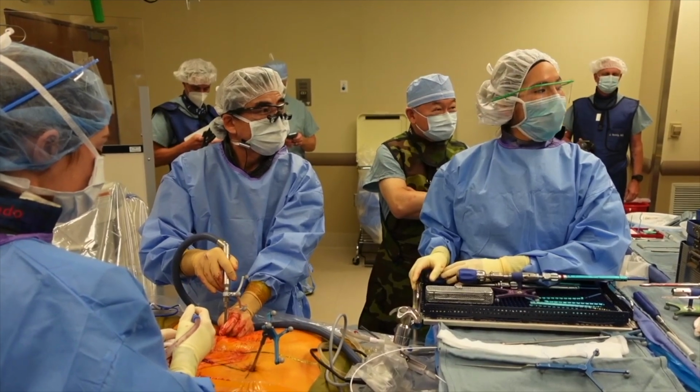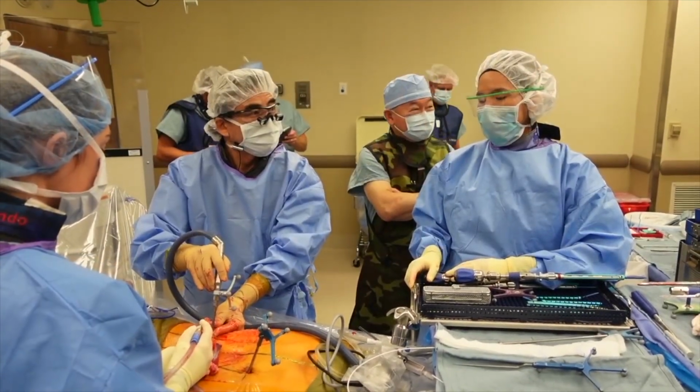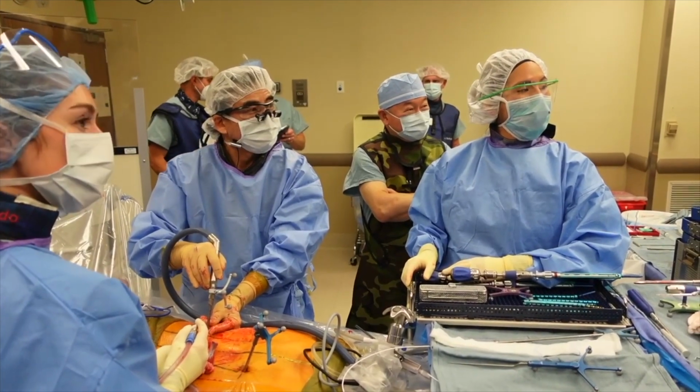Cheating, huh, Terrence? Yep, it's right on a bone spur right there. Look at that.